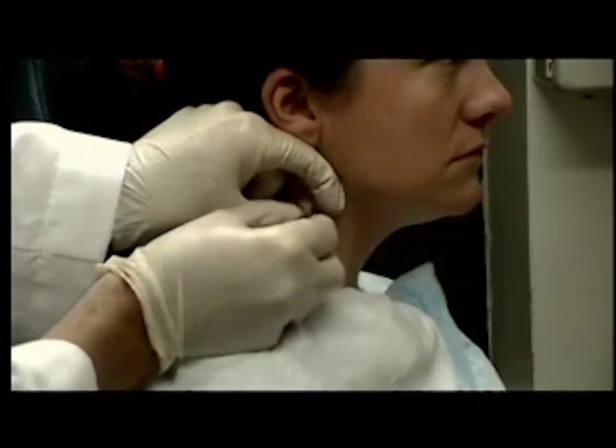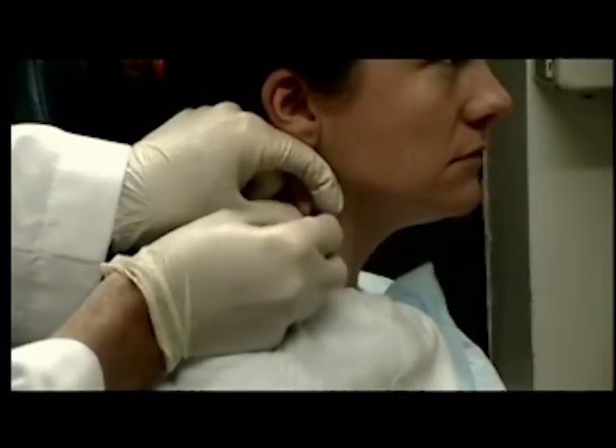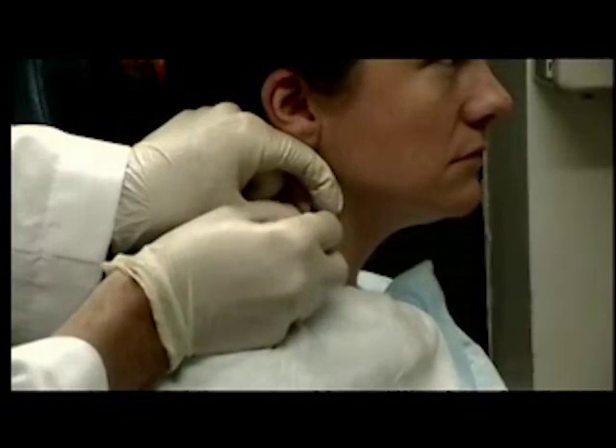Then, quickly go in and out of the node while turning my fingers clockwise and counterclockwise. Then out.